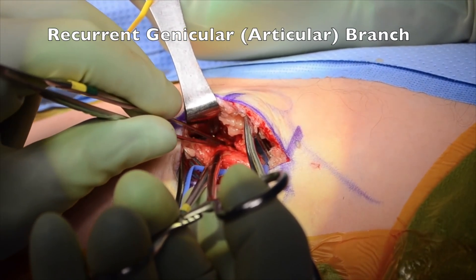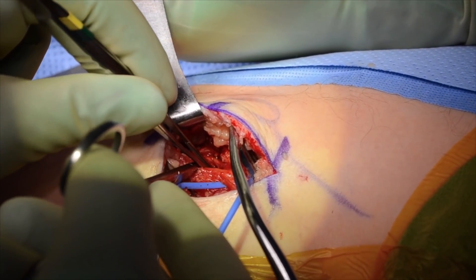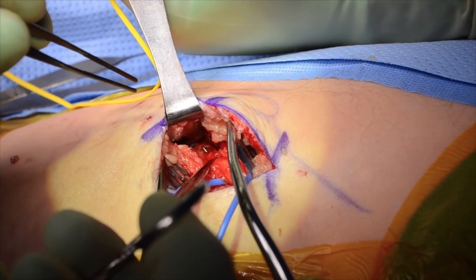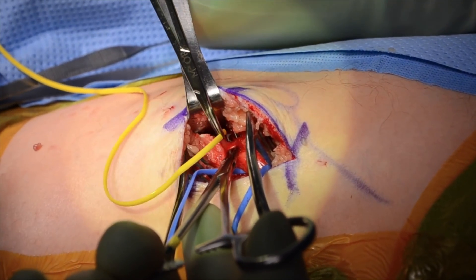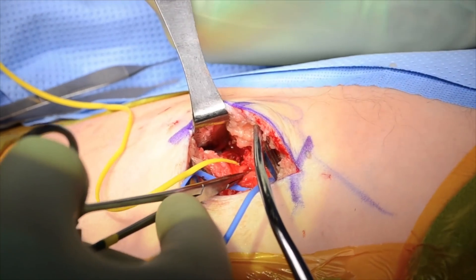The recurrent genicular or articular branch, shown here, courses towards the superior tibio-fibular joint. Once isolated, each branch is marked with a yellow vessel loop.